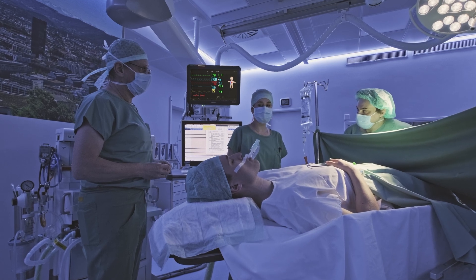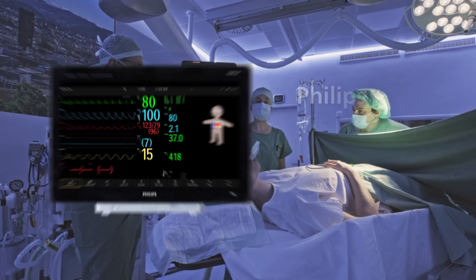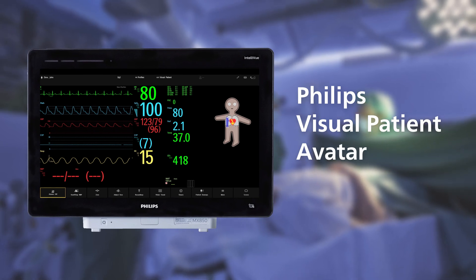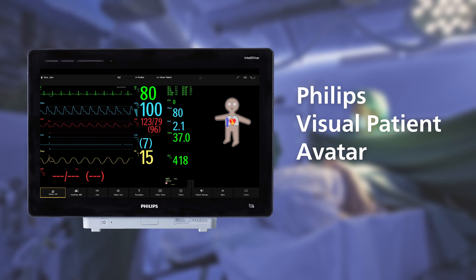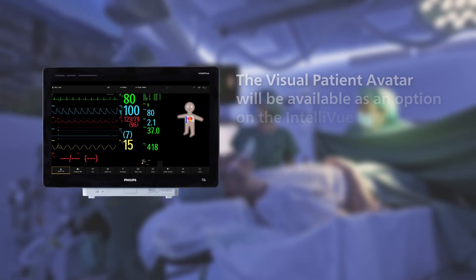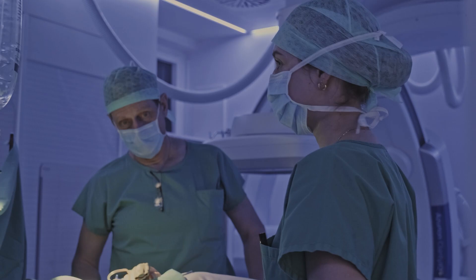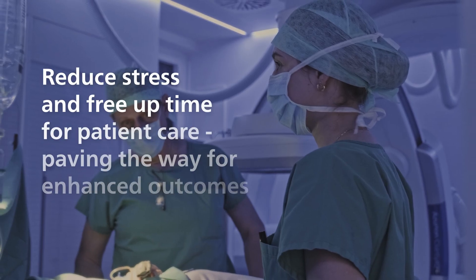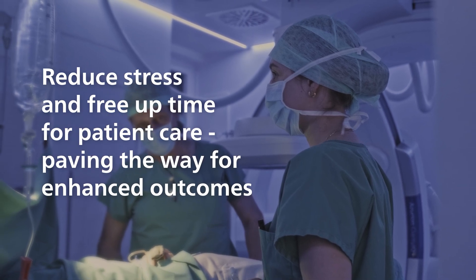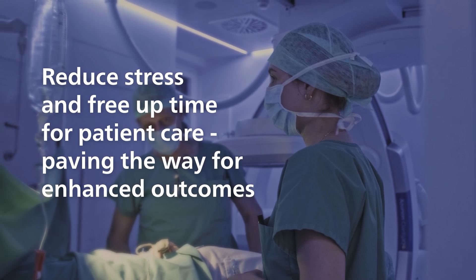Now, the Philips Visual Patient Avatar is being introduced into the OR environment in a gated release for first-of-a-kind customers. This innovation will initially be available as an optional feature on a wide range of IntelliVue MX patient monitors. Tests and studies with caregivers have shown that the Visual Patient Avatar can support efforts to reduce stress and free up time to focus on patient care and outcomes.